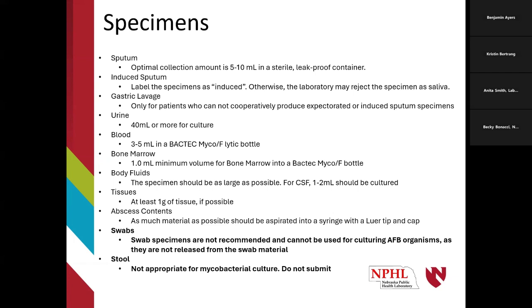Of course, our main one is sputums. We also have other respiratory cultures, BALs, bronchial washes, gastric lavages, urines, bloods, bone marrow, body fluids, tissues and abscesses.